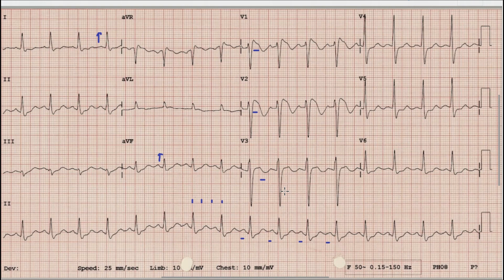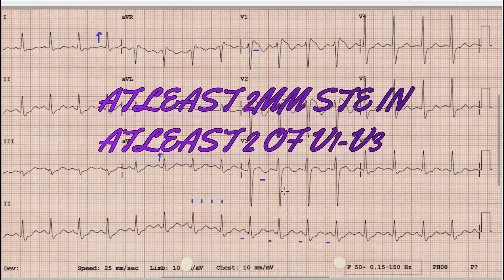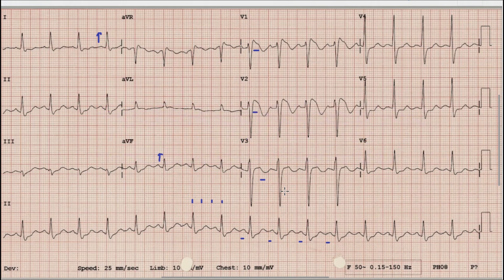For diagnosis of Brugada pattern, especially Type 1 Brugada pattern, there should be at least two millimeters of ST elevation in at least two or three leads — that is V1, V2, and V3. This ECG presentation is called Brugada pattern.